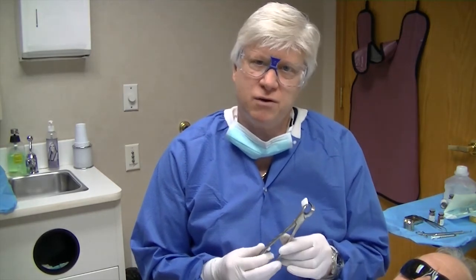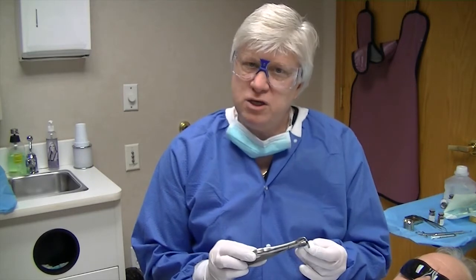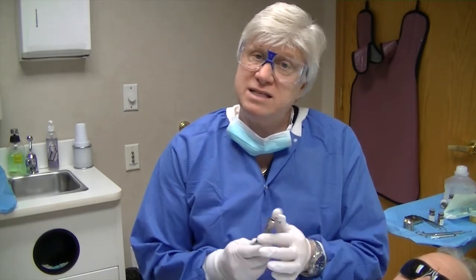The forcep is similar to what you've seen with other Golden Physics forceps, but the design is a little bit unique. It allows us to use the bumper region in a very shallow vestibule area. We still have a beak that will engage the lingual surface. What's nice about the system is there are two forceps, and you can actually use it contralaterally — meaning you can put the bumper on the lingual surface if you needed to for access.